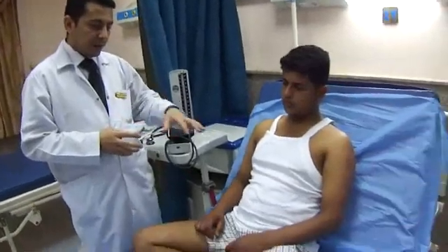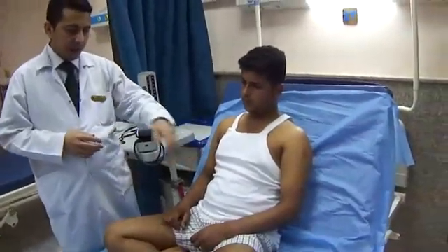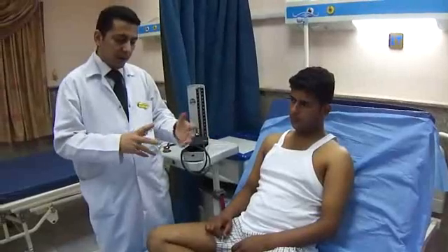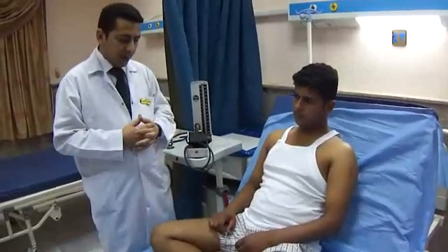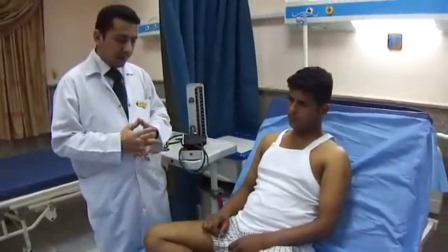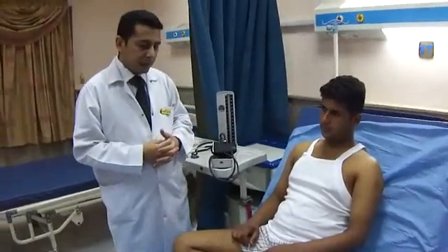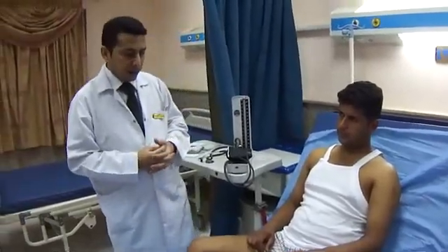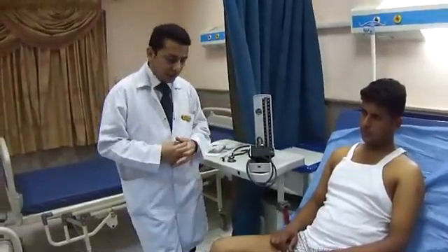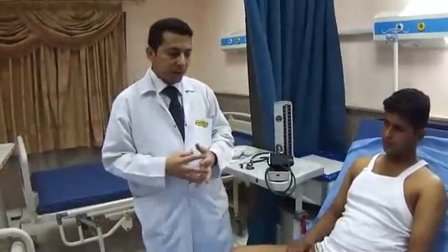Assessment on one side should be followed by assessment of the contralateral side — first measure on the right side and then the left side, taking the highest reading. There may be a difference in blood pressure of about less than 10 millimeters of mercury, which is normal.